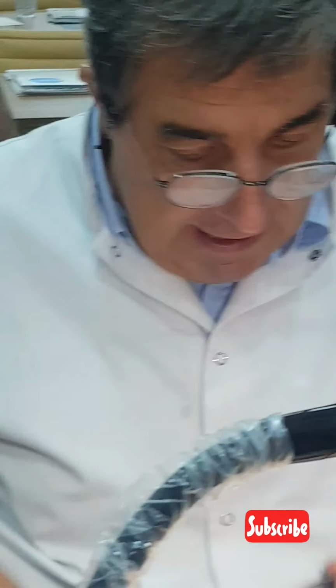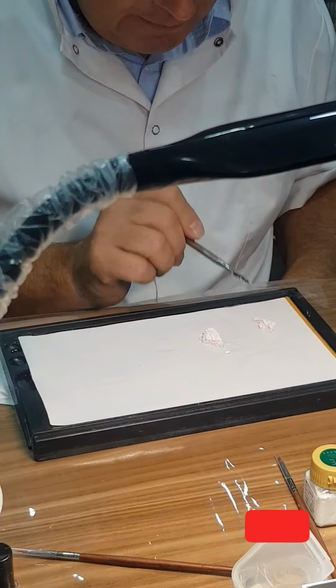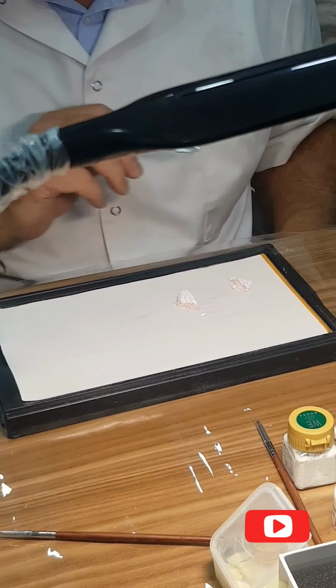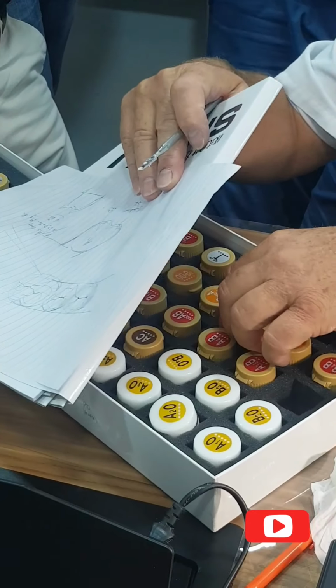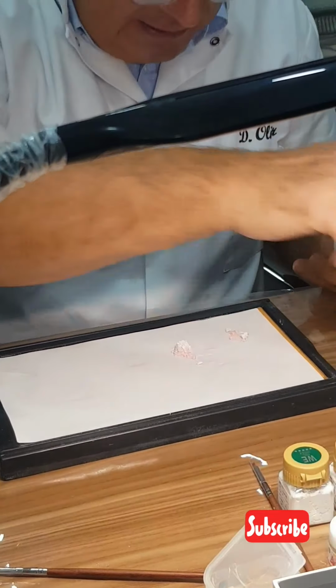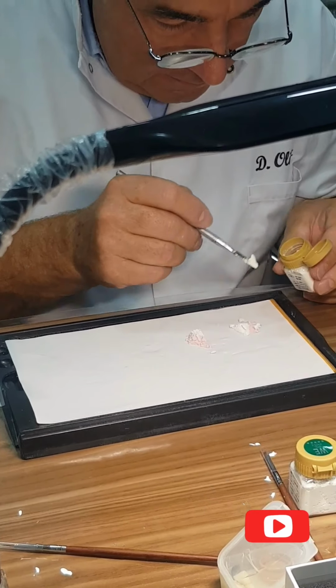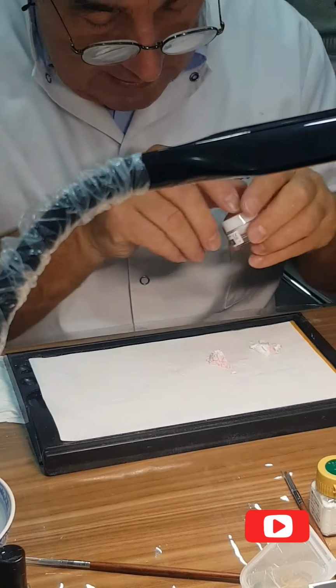Okay, I have a root to do. What am I going to do for the root? Opaque dentine. Okay, opaque dentine, B3. Oh, B4 is better, more yellowish. Opaque dentine B4, half and half, and a small quantity of orange.